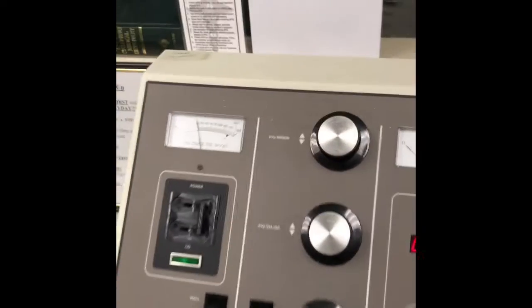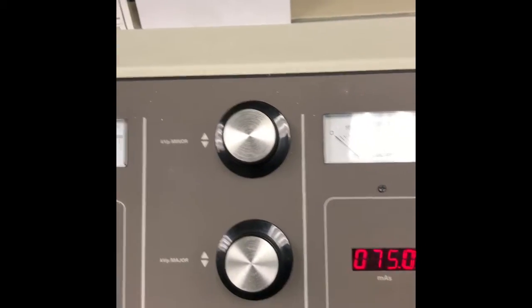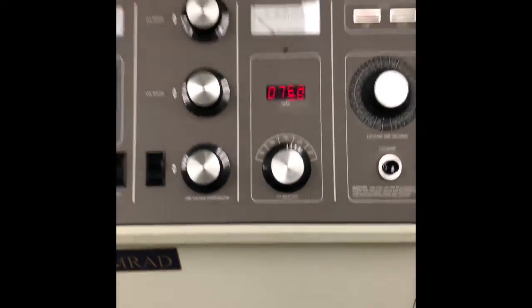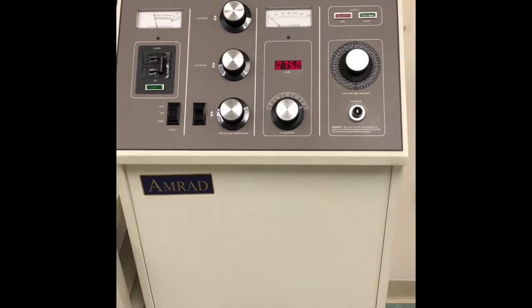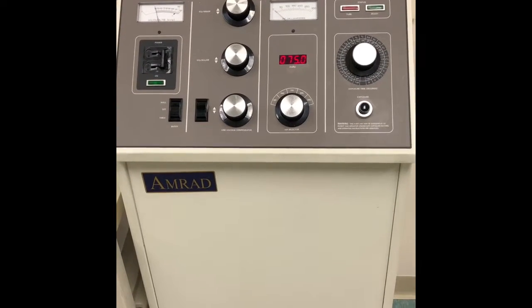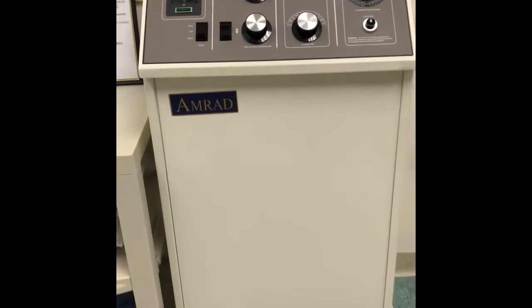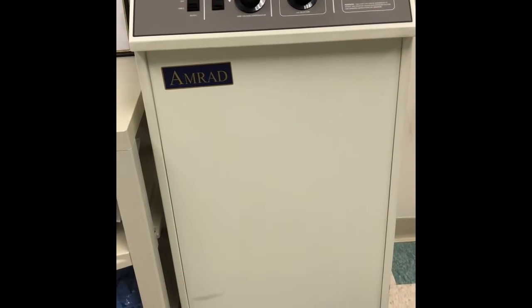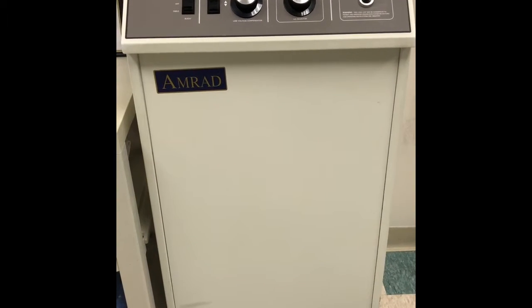Now, I am able to touch the mA selector and all these things because we have a ground. And I'm also able to touch the X-ray tube because of the ground that we discussed. The ground basically just prevents us from electrification. And that is the console and main breaker. In order to see the transformers, you would have to open that up and you'd be able to see the number of coils and turns on each transformer and whether it's a step-up, step-down, or the auto transformer.